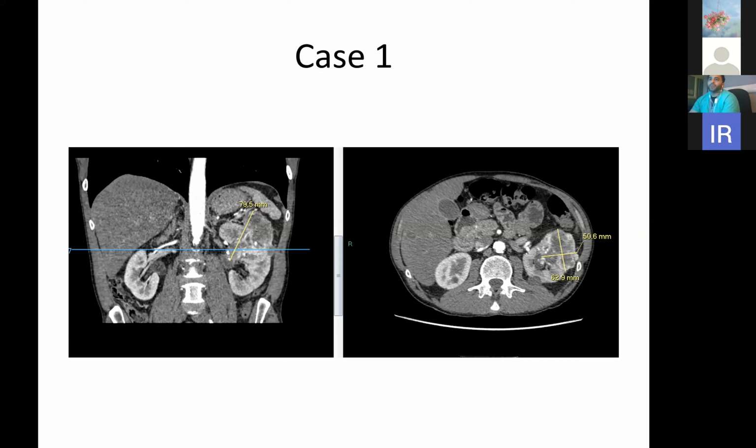Okay, well, a generic approach is, first of all, where is it located? Which part of the body is it located in? Where is it coming from? What are the local structures next to it? Does it involve vasculature? Does it involve other structures, such as in this case, the renal pelvis? So that is just a general overview of what I would do.